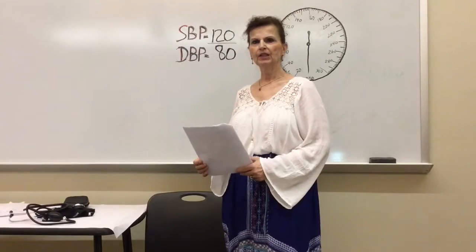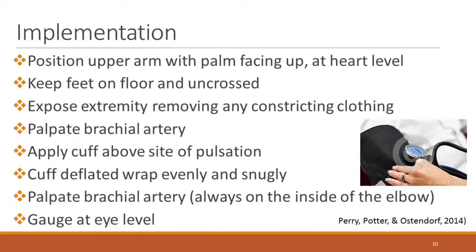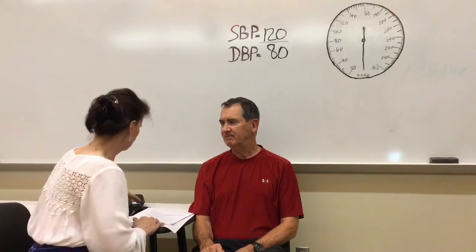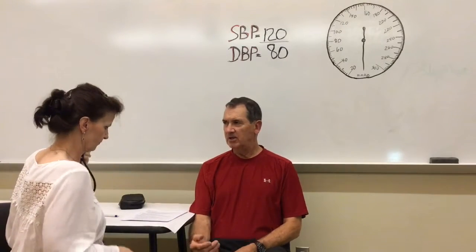Okay, so now we are ready to take our blood pressure, and we'll ask our patient, Mr. David, to come up and have a seat. How are you? Good. Is there a particular arm the doctor or nurse uses to take your blood pressure? Usually my right arm. Okay.